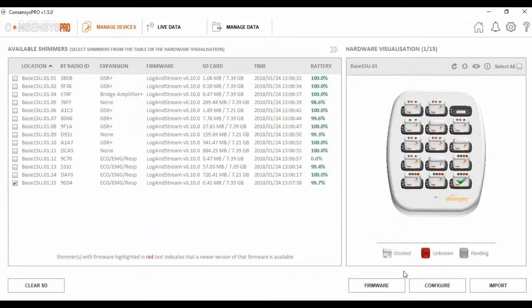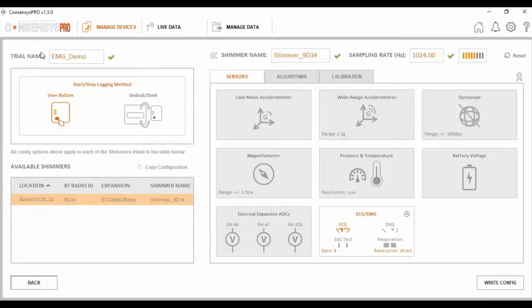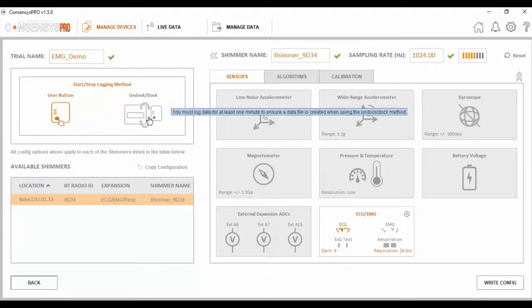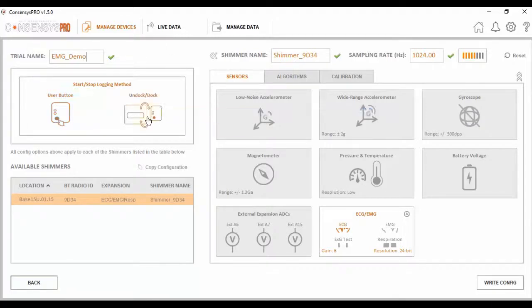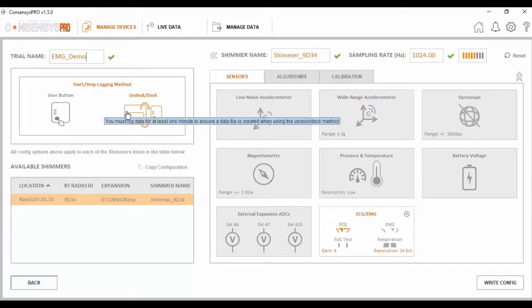Next, we must configure this unit. First thing I want to do is set a unique trial name. Following this, I want to consider what logging method to use. With the UndockDock method, when I undock the Shimmer from the Consensus Base, it will automatically start logging data to the inbuilt SD card on the unit. With the user button option, the orange user button on the Shimmer acts as a start and stop button. For the purposes of this, I'm going to use the Undock method.